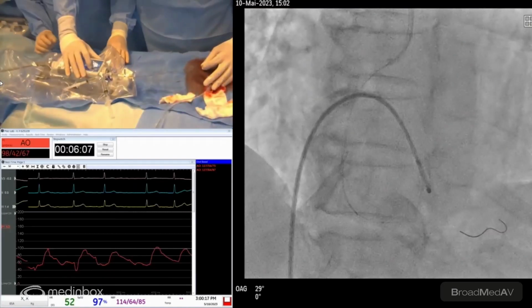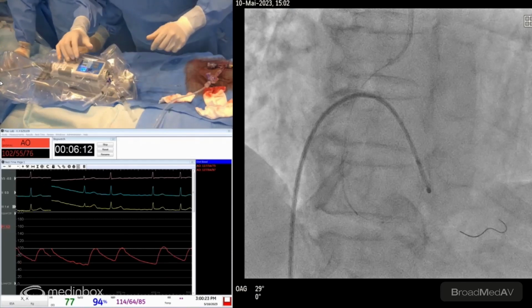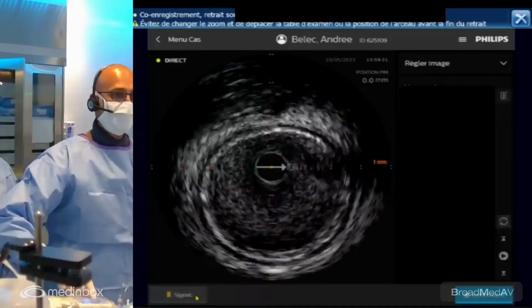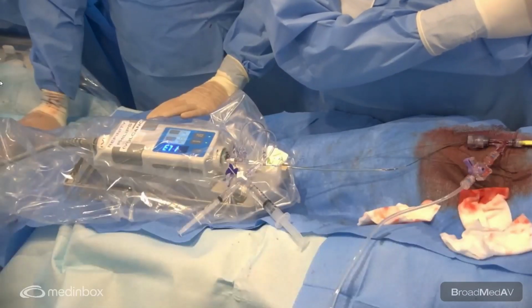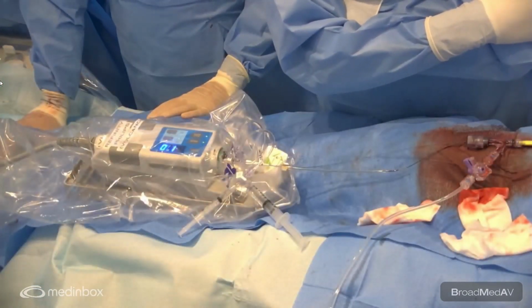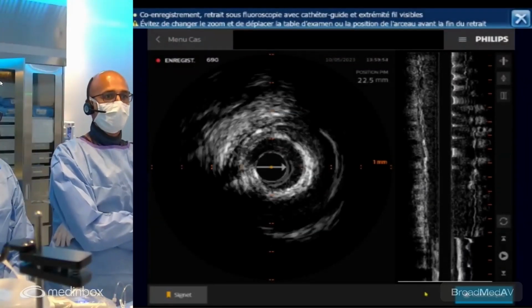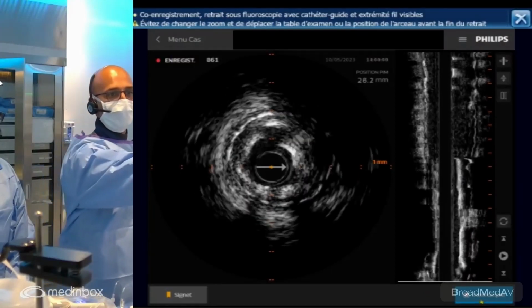All right. So let's get some images. Can you show the IVUS to the crowd? Auto, go on 1 millimeter image and put it straight, and we'll pull back. Here we go. Large vessel. Very nice. Okay, so it's free of disease here. Going to measure the distal size afterwards. I think this would be our landing zone. Let's look. We started with a calcium arc. There we go. That's a 360 calcium arc. There are zones of fracture at 11 and 5 o'clock.